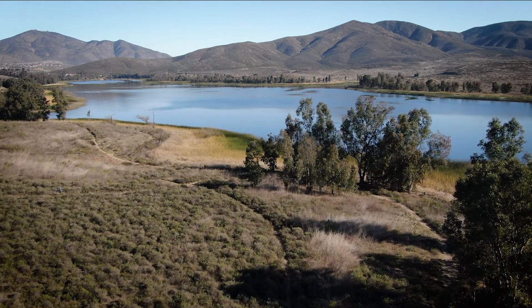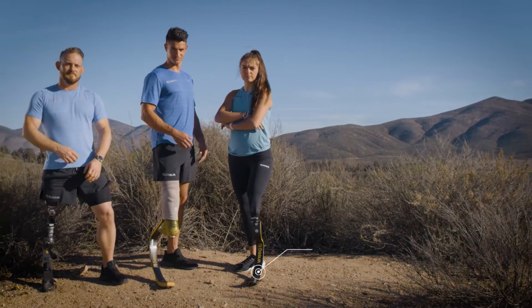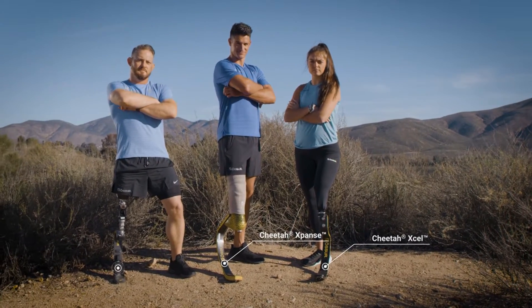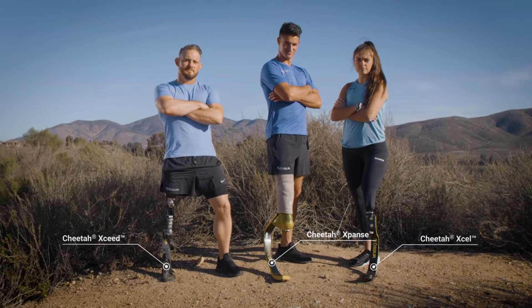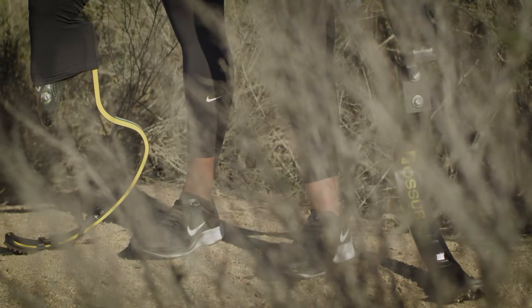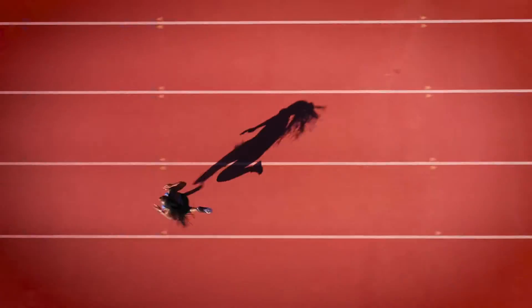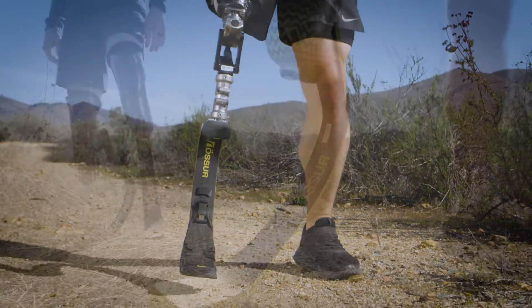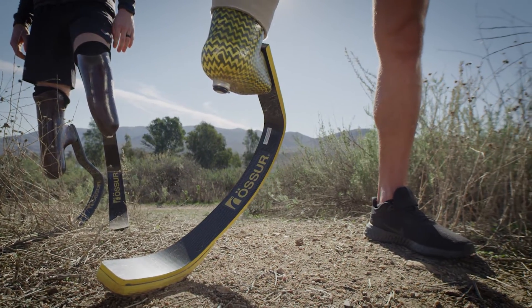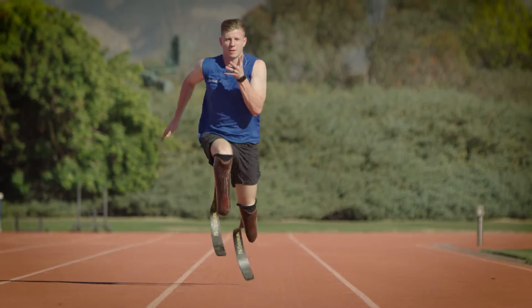The next level of prosthetic performance has arrived. Introducing Össur's expanded Cheetah family of sports feet. These are the most technologically advanced sports feet Össur has ever produced, each specifically designed and purpose-built to maximize an athlete's inherent potential and help them reach their athletic and fitness goals.